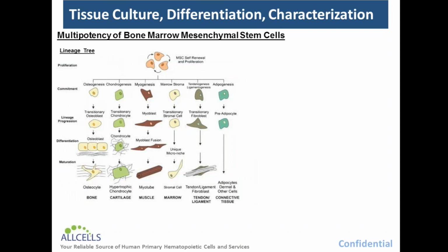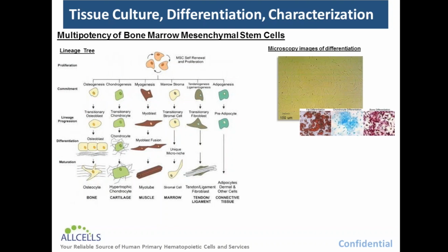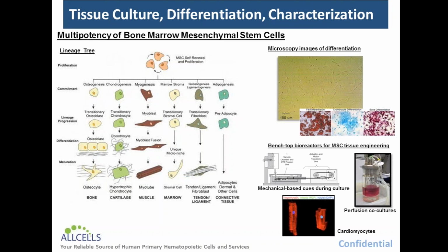Aside from the hematopoietic system, other cell types and lineages are achieved through culture and differentiation. This includes tissue derived from mesenchymal lineages derived from the stromal portion of the bone marrow. These cells are multipotent, grow in adherent cultures, and often require more than just chemical cues and treatment to achieve certain phenotypes. For example, in generating muscle cells, and in particular cardiomyocytes from mesenchymal stem cells, additional mechanical cues are required to achieve the correct tissue morphology.